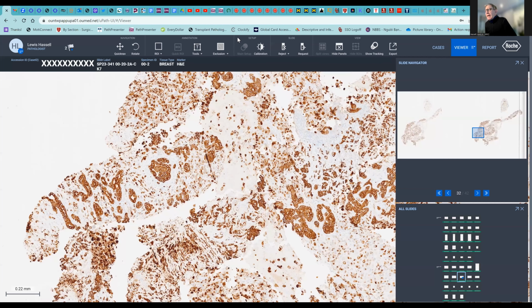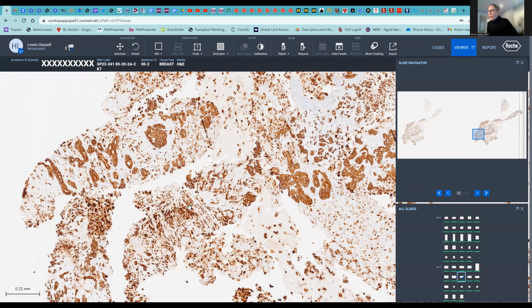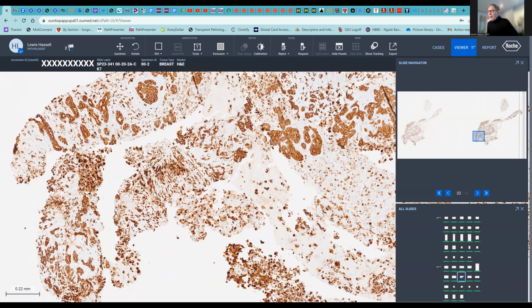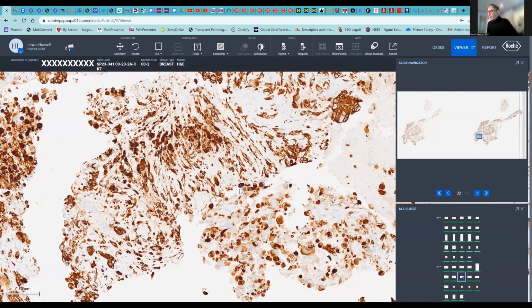So we did some immunohistochemical stains, and this is an example of one of those performed on the pancreas. Several of these were also done on the liver to verify that the immunoprofiles in both tumors were quite similar. But here we can see the CK7. As you can see, it's nicely decorating the glandular structures. But notice here also that these spindle-shaped and stromal cells, as well as these bizarre cells, are also lighting up nicely with this marker.